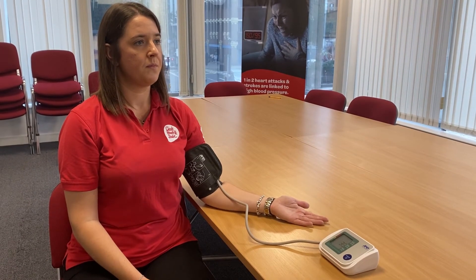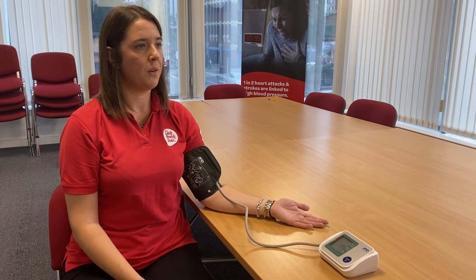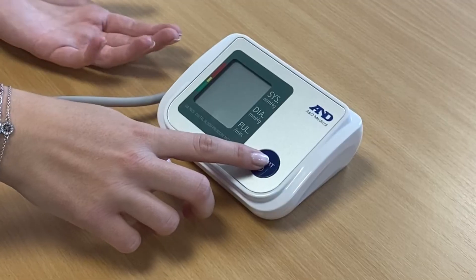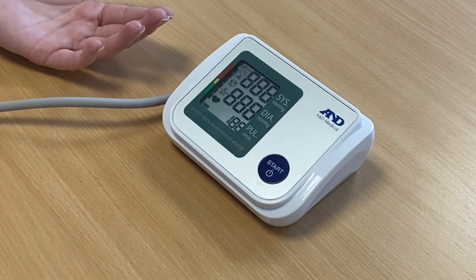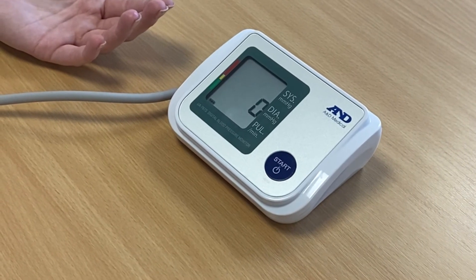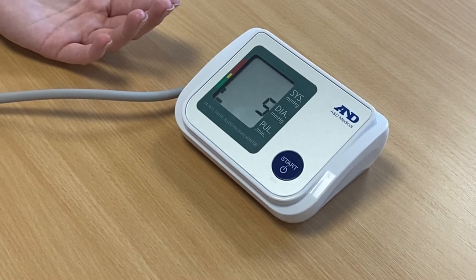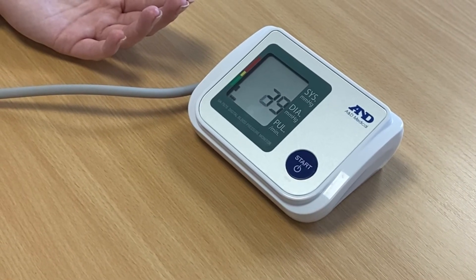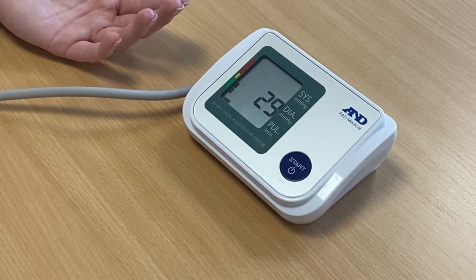It is important that you sit still and do not talk during the test, as this can affect the accuracy of the result. When you are ready, press the start button on the blood pressure monitor. The cuff is pumped up to restrict the blood flow in your arm. This squeezing may feel a bit uncomfortable but it will only last a few seconds.